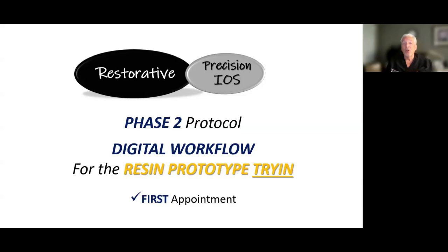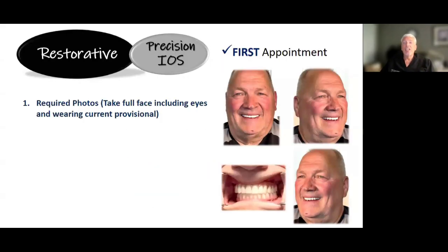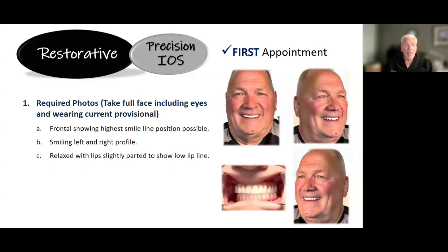This I'm showing you is for the resin prototype try-in, and I really strongly recommend a try-in, and I'm going to show you why here. All right, so here's your first restorative appointment. Implants have been integrated. And here we are. Patient shows up, and this is my buddy Tim.